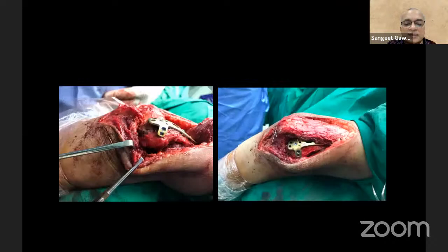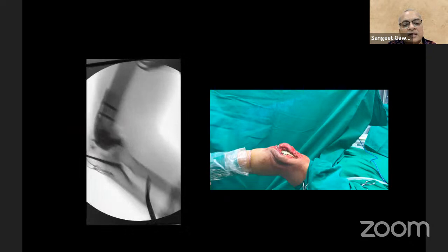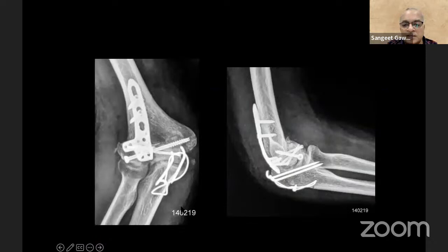And this is how it looks after suturing and then completing the fixation of the olecranon osteotomy. This is on table what we have got. He has a good extension, okay, and then a complete flexion. He is thus 20 degrees short of extension and a complete flexion. That is how we got the range of movement. And this is his post-op X-ray at 1 year. This is the immediate post-op X-ray.